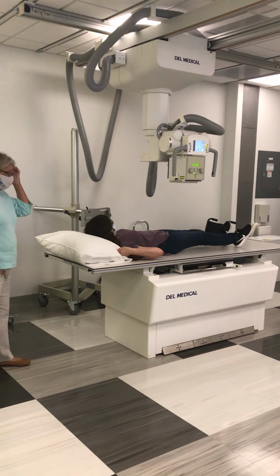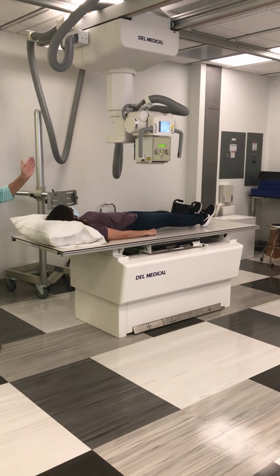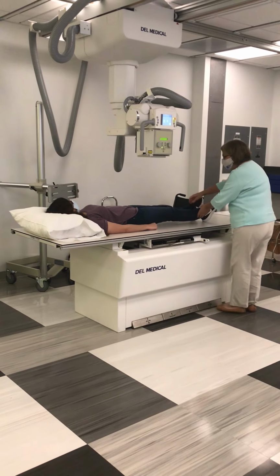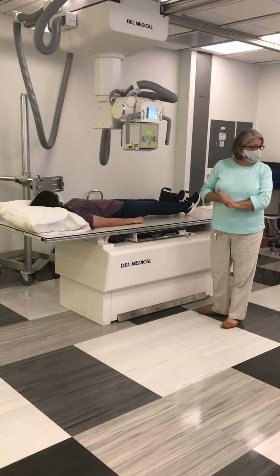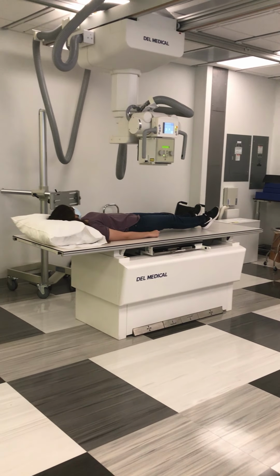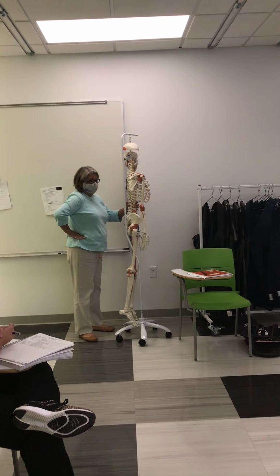The second part of the positioning is that we need her to be straight on the table, head to toe. We can't have her lying diagonally on the table. I'm just going to move your legs just slightly to your left. Thank you. Now I have my patient positioned where I want her. It's time to center.